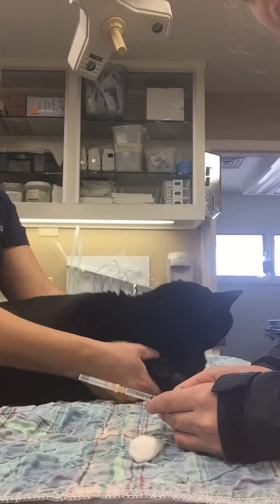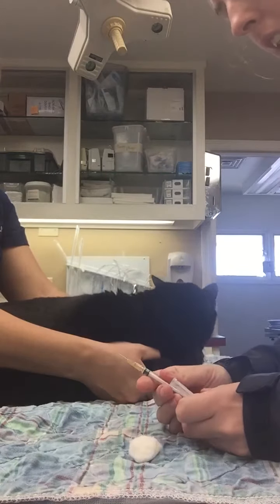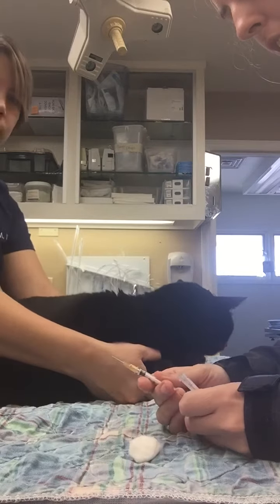Pull him back on my plunger to break the seal. I will also inspect my needle to make sure that there's no abrasions or damage in any way.